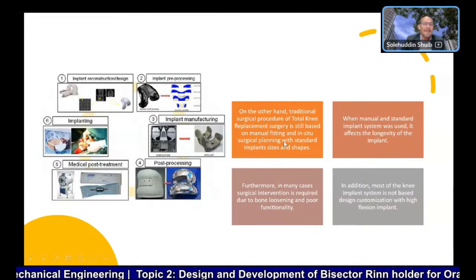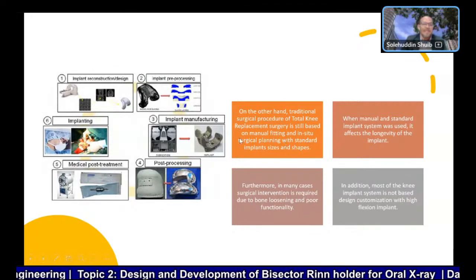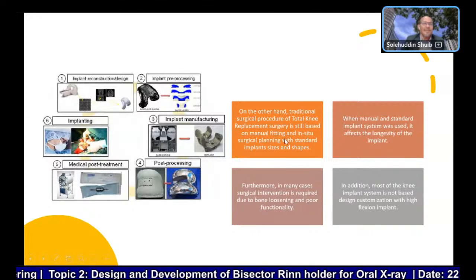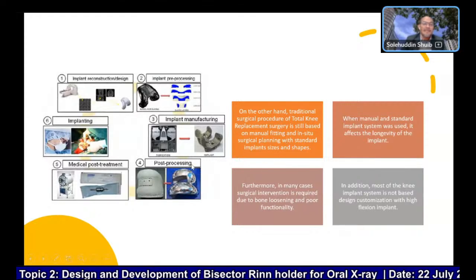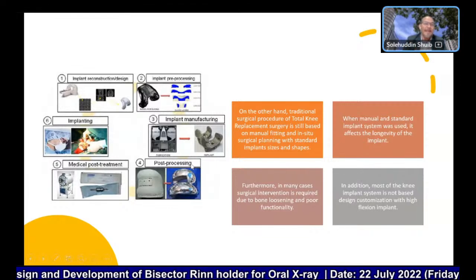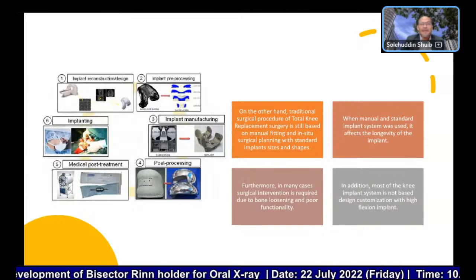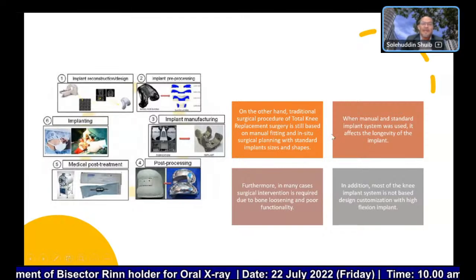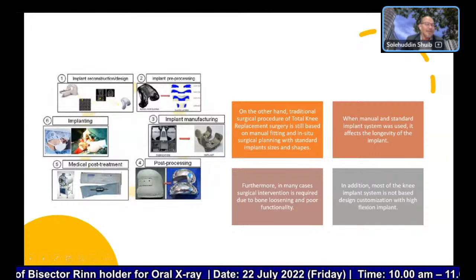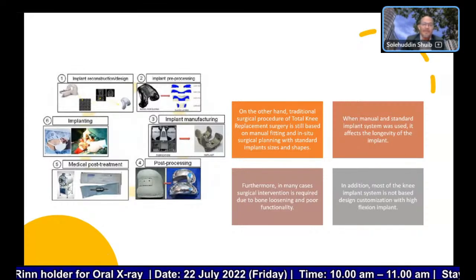At present, there is what we call a traditional surgical procedure, which is still based on manual fitting, in situ surgical planning, with standard implant sizes and shapes. When a manual and standard implant system is used, it will affect the longevity of the implant.